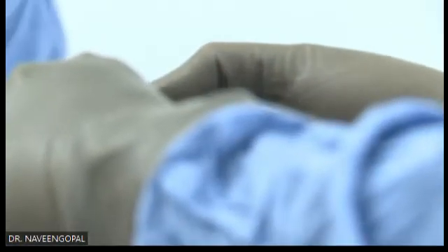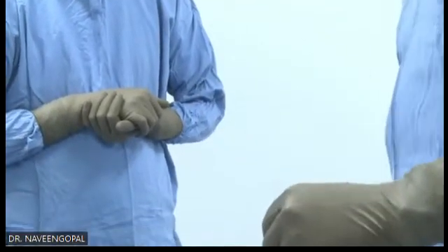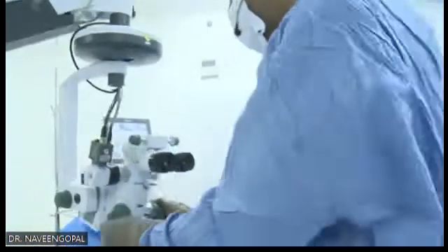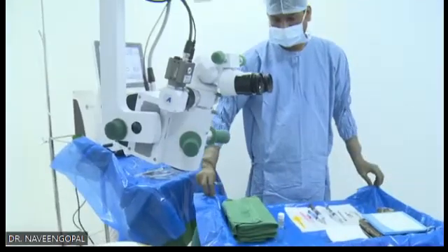And the hole should be on your left side before you place the ICL. These two things you make sure. Don't hold the ICL in the middle, hold it always in the periphery. And since I'm presbyopic, I always do my loading in my microscope, which is safer, so I'll go to my microscope now. Go to the microscope view.